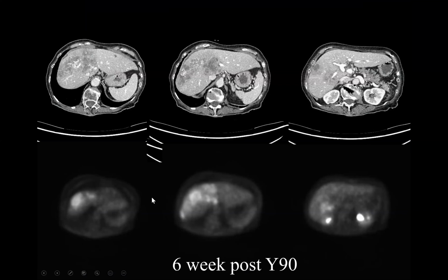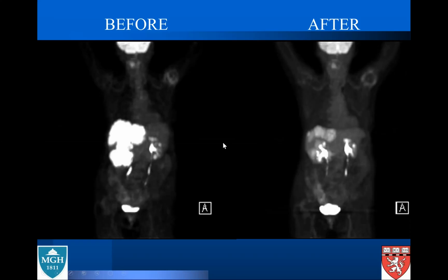Again, these are palliative treatments. We have good situations where we really treat well, but this tumor did come back over time. But this was like a nice, single treatment, very limited side effects, and before and after, you can see it helped. All right, one last case.